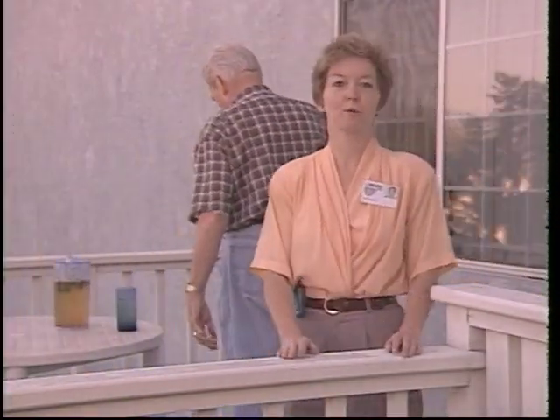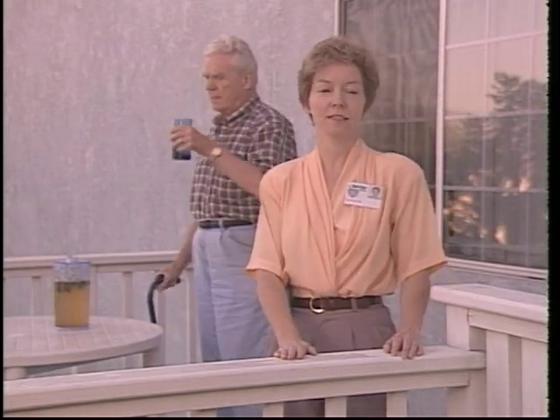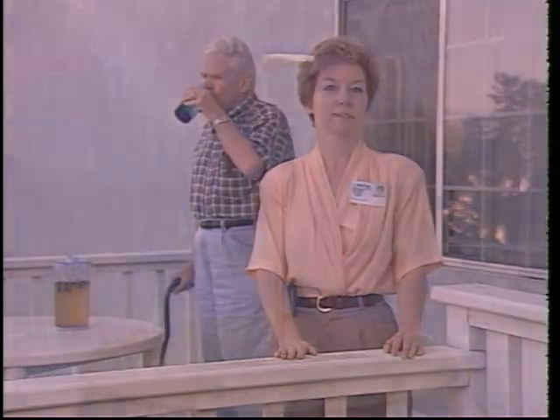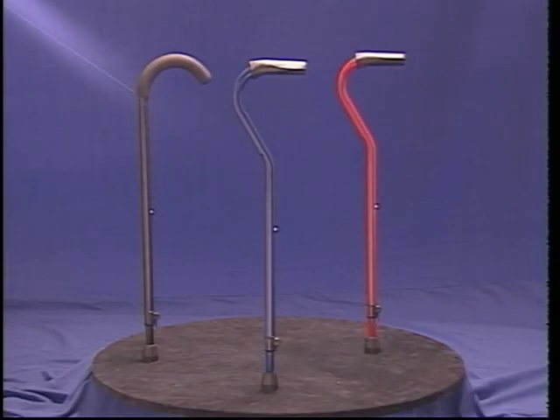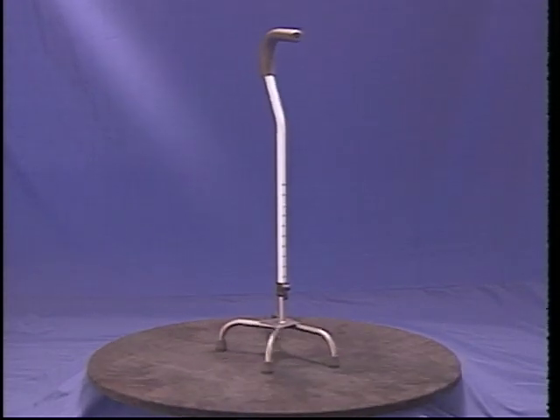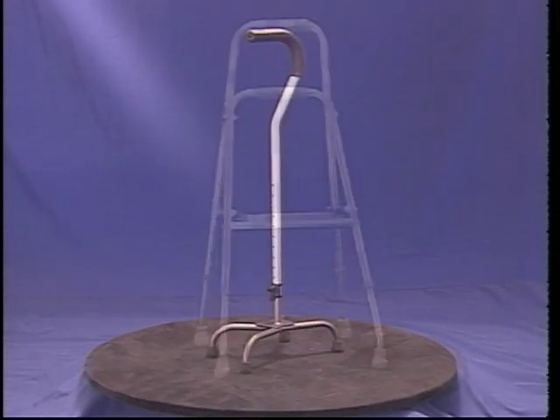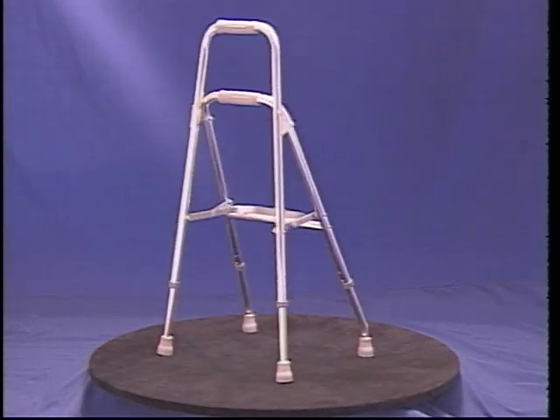Let's talk a little about the mobility devices we're covering. First, canes. Canes aid balance and stability when walking or standing. There are three main types of canes: single canes, quad canes, when more support is needed and the user has the upper body strength to control it, and hemicanes, for clients suffering from hemiplegic or one-sided paralysis.